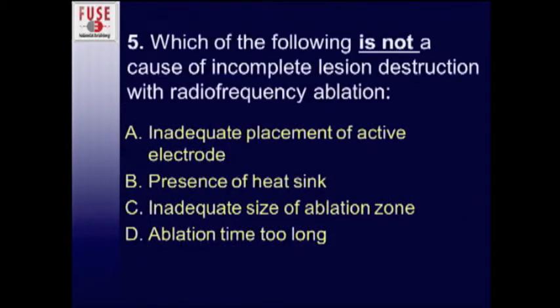Question number 5. Which of the following is not a cause of incomplete lesion destruction with radiofrequency ablation? So pick the false answer. A, inadequate placement of the active electrode. B, presence of a heat sink. C, inadequate size of ablation zone. Or D, ablation time too long, which is false.